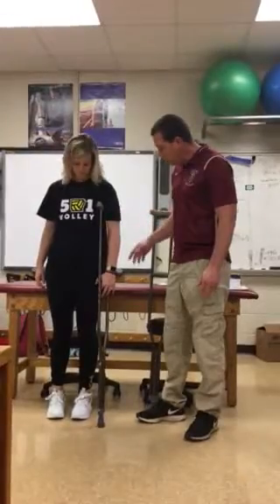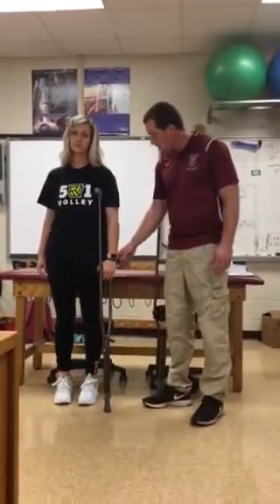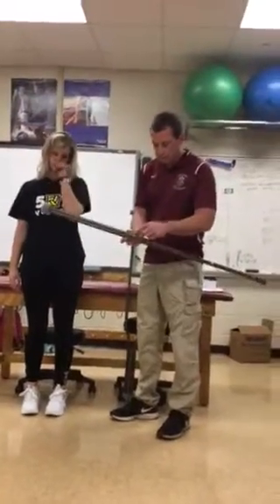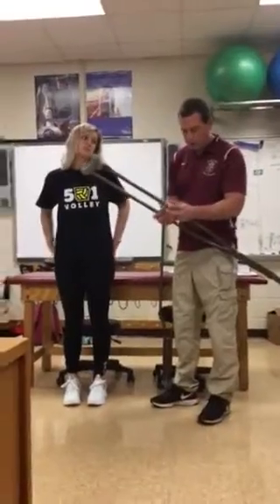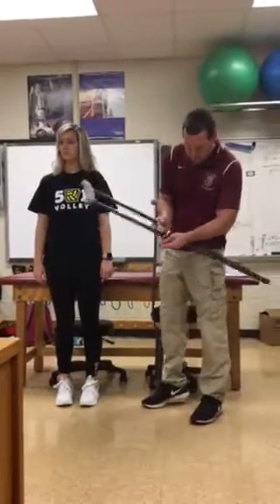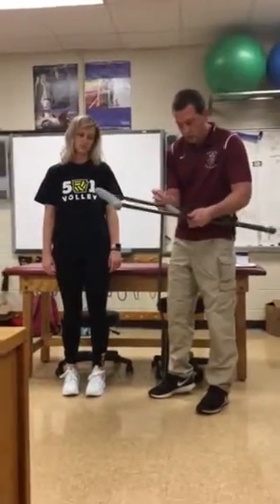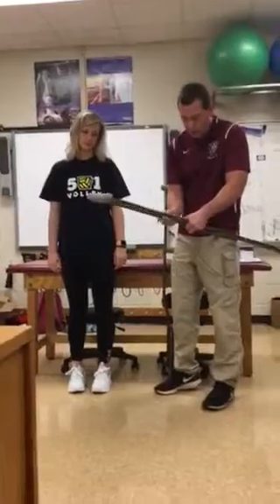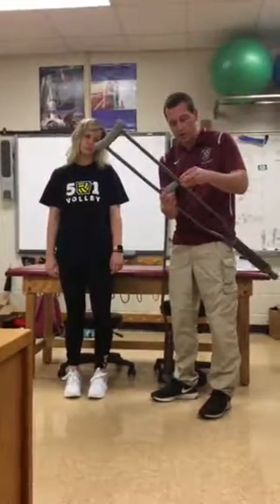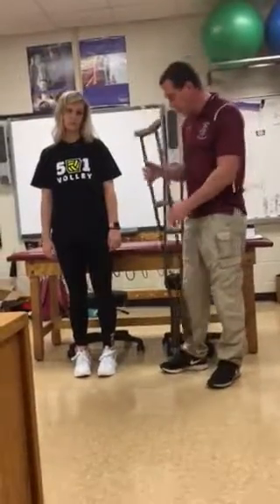The other thing you need to notice is you want there to be about a 30-degree bend in the elbow with where their hand is placed on the supporting part of the crutch. This one is extending her out too much, so I'm going to show you how to move this piece up. You just undo this nut here, take the washer off, then pull the bolt out and move it up. After you get it adjusted to where you want it, put the bolt back in, put the washer back on, and then do the wing nut.